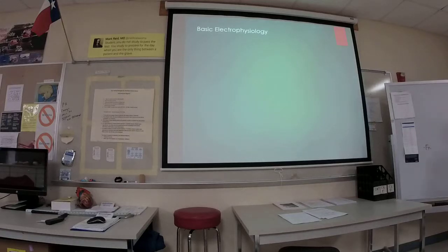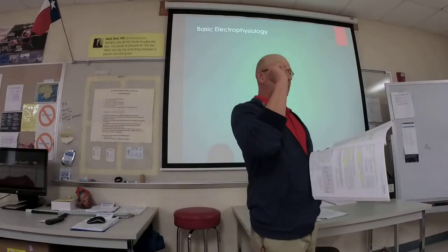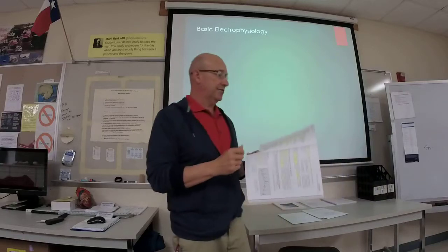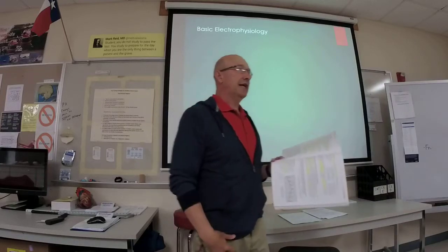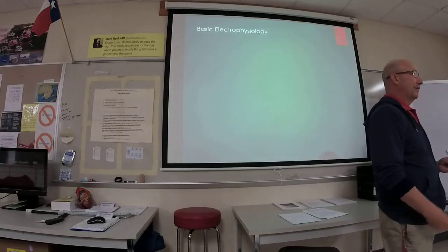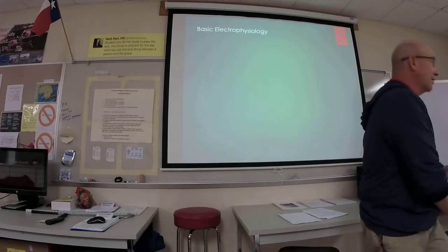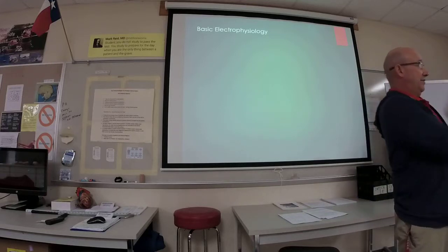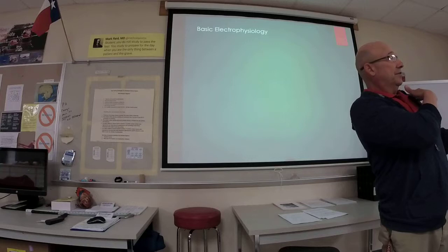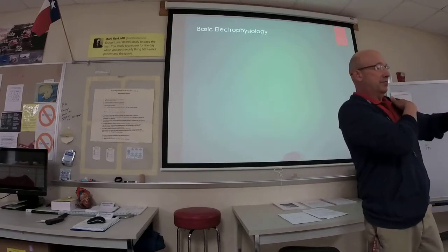size electrodes. I've run across this question about amputations and implants in the questions that you guys are going to do. If they have an amputated leg or an arm, you just don't leave the electrode off, right? If there's no leg to put it on, just put it on the abdomen. If there's no arm, just put it in the socket. That's fine. Put it on the chest wall, this little space right here.